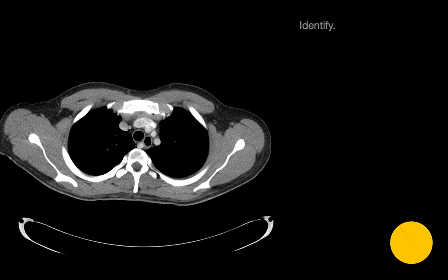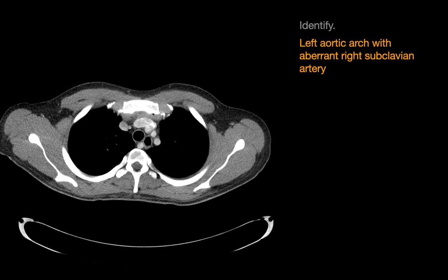Identify this anatomic variant. In this particular case, we saw a left-sided aortic arch, but a great vessel coming off the thoracic aorta courses posterior to the trachea and the esophagus. The esophagus is slightly dilated here. This is an example of a left-sided aortic arch with an aberrant right subclavian artery.